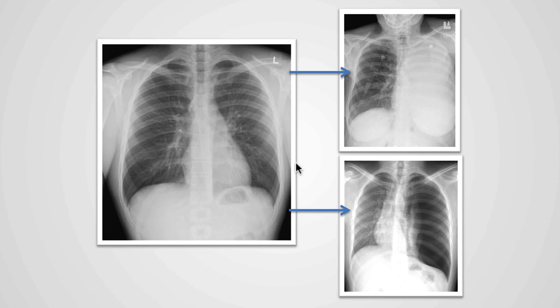Here we have an example of a normal chest x-ray. If we focus on the left hemithorax, this is what normal looks like. In this next example, we see that the left hemithorax is too white. The reason the left hemithorax is white is because the left lung is collapsed.